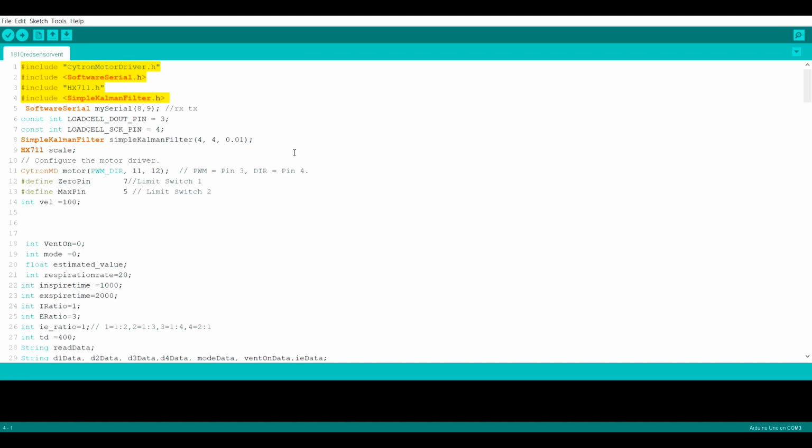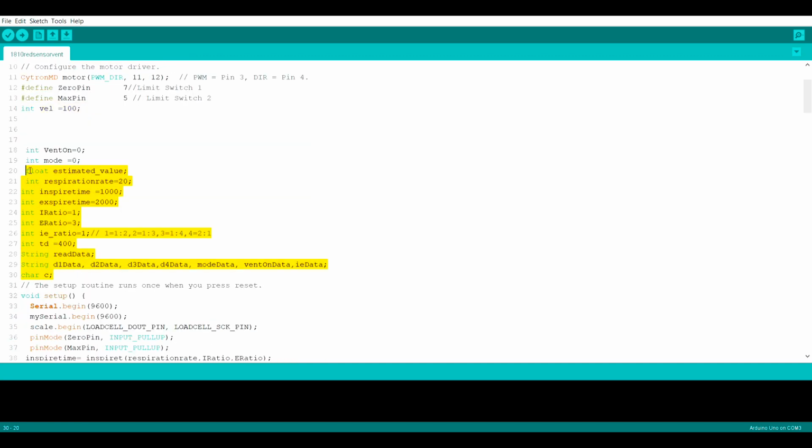Firstly, we will include the header for Arduino and the breath sensor or the pressure sensor, and then we will set up the serial for ESP and the pin of the sensor. Then we will scale the pressure sensor and then determine the pins of the motor, which are 12 and 11, and then pins 5 and 7, also the bell.